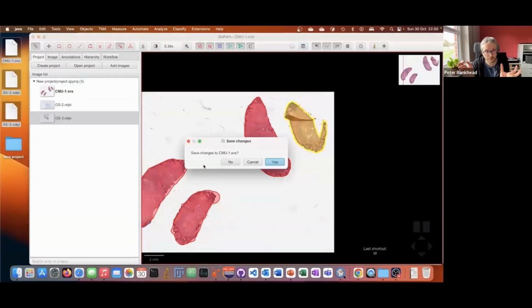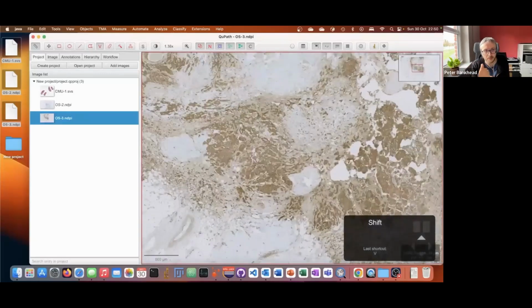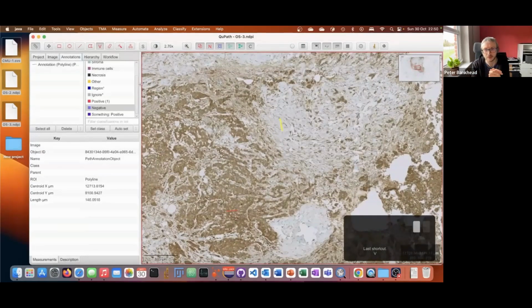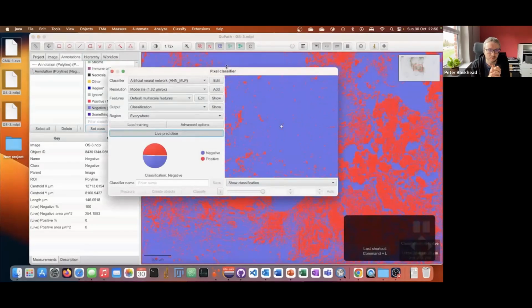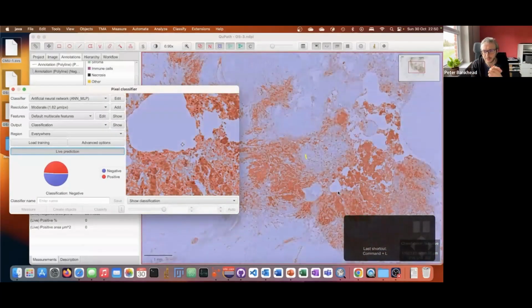I created a results table, and what you should have seen there is that, unlike the ImageJ results table, you get little thumbnails of the things that you've annotated alongside the measurements visualized in QuPath, and we'll see later how that's possible. In this case, we want to quantify, in this 30, 40 gigabyte whole slide image, the proportion of the tissue which is stained brown.